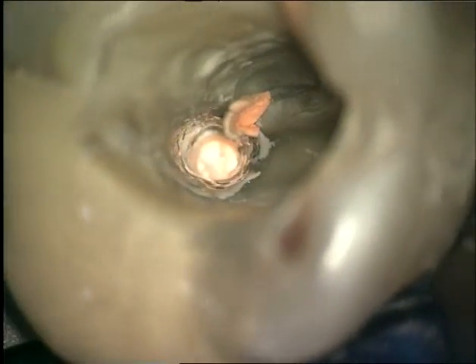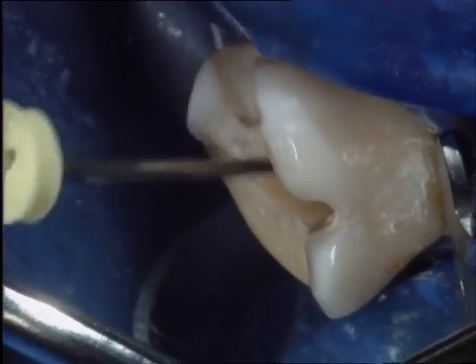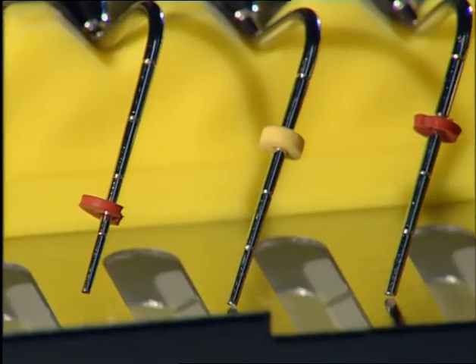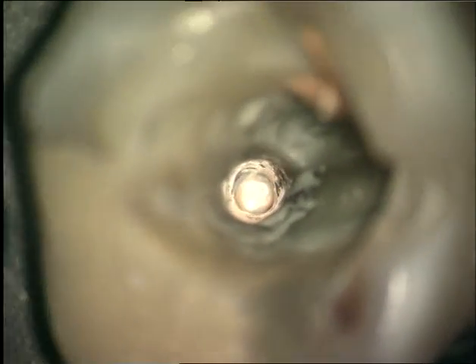The plugger is stepped circumferentially around the canal while plugging apically with firm, short strokes. It soon becomes appropriate to select the next smaller plugger as the narrower portion of the canal is approached, so that the plugger never meets resistance on unyielding dentinal walls. Depending on the canal length and size, the same plugger may be used several times.